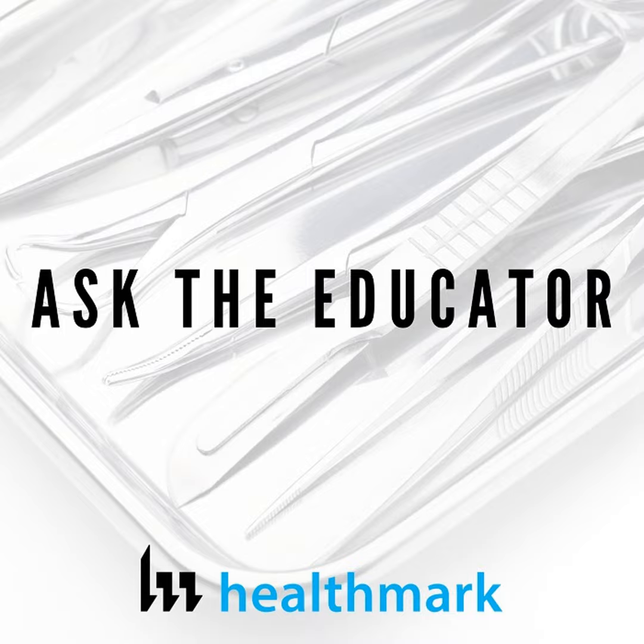Actually, multiple great points, Adam. One of the things you touched on was the IFU. One thing I find typically with IFUs is, you're correct, most of the main arthroscopic shaver manufacturers have included borescope inspection now, with the exception of one that I found that does not. And that's where the recommendations from AORN and AAMI come into play, and hopefully you adopt that practice regardless, because it's that important. Circling back to the IFU, many people do not know how to access the IFUs, or are unaware of the fact that there's a lot of information in the IFUs specific to cleaning and inspection. It's not just all about sterilization. Sometimes people don't even know how to access the IFU, or they haven't accessed an IFU since their orientation, and that's a really important piece of the puzzle.